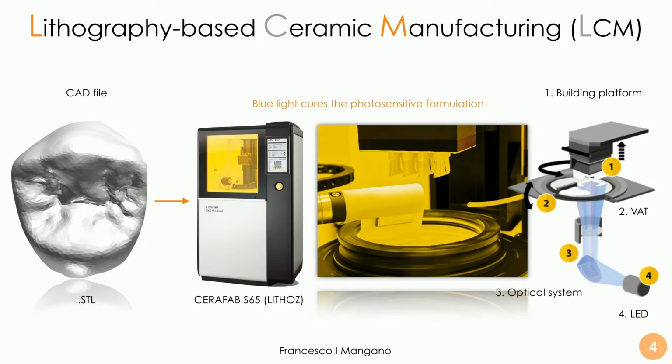The technology used for 3D printing, in this case restoration, is the lithography-based ceramic manufacturing, LCM. That is a proprietary technology by Lithoz. This Austrian company is one of the most important companies in the world in the field of 3D printing of ceramics, not only zirconia, but also lithium disilicate in our field, for our application specifically, but also in the medical field. So the dental field is a little field compared to the medical one.